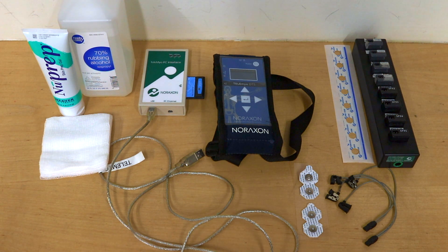Furthermore we'll need some gauze, some new prep, and some rubbing alcohol to prep the skin before we attach the electrodes on whoever we're testing.